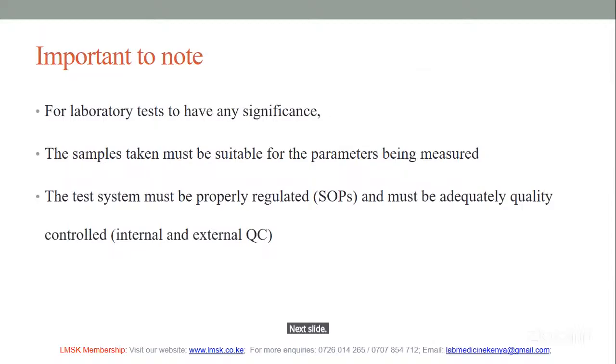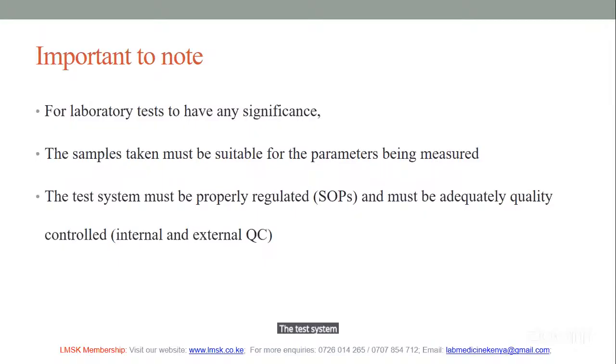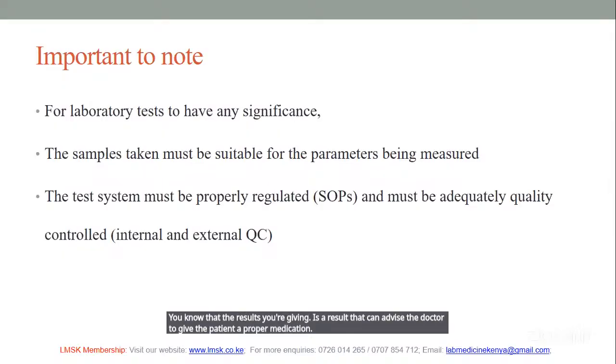Important to note, for laboratory tests to have any significance, the sample taken must be suitable for the parameters being measured. The test system must be properly regulated, that is SOP, and must be adequately quality controlled, so both internal and external QCs must be run so that you know the result you're giving is a result that can advise the doctor to give the patient proper medication. Next slide.